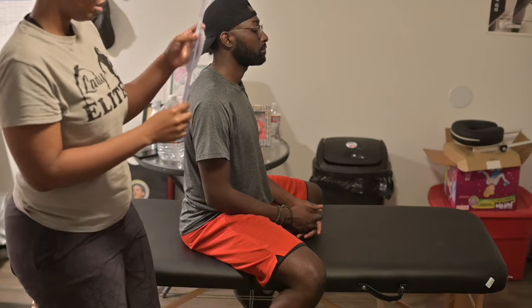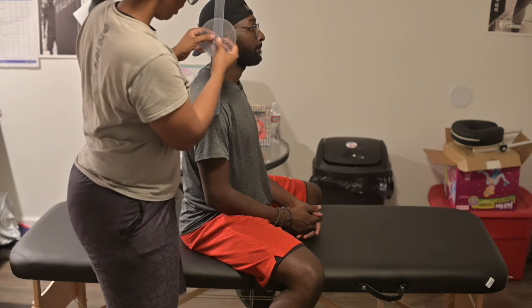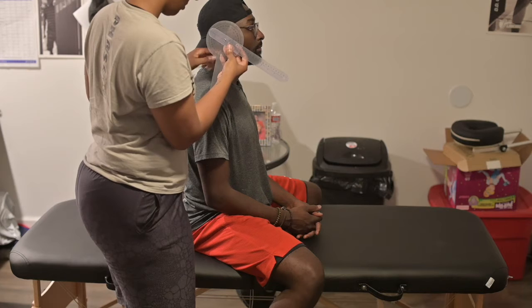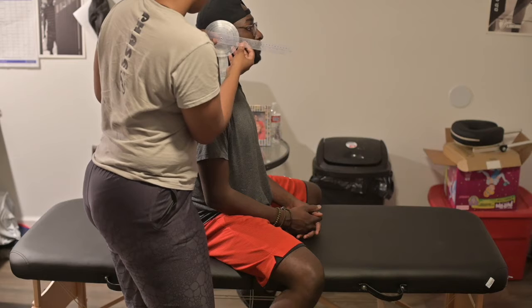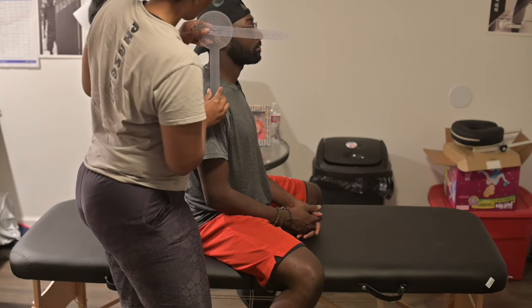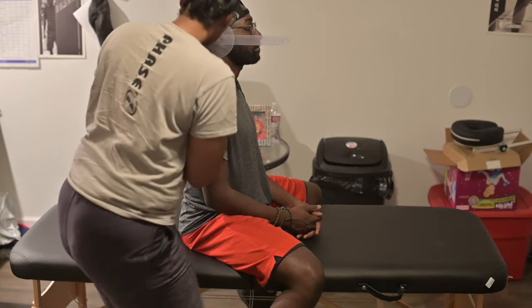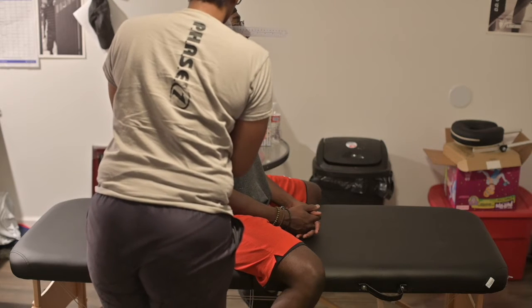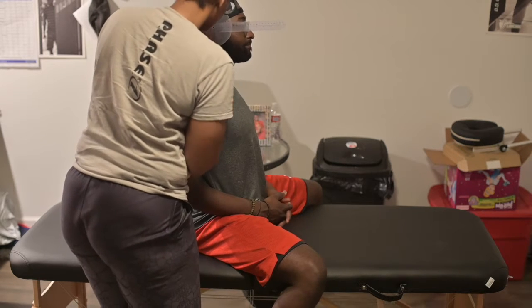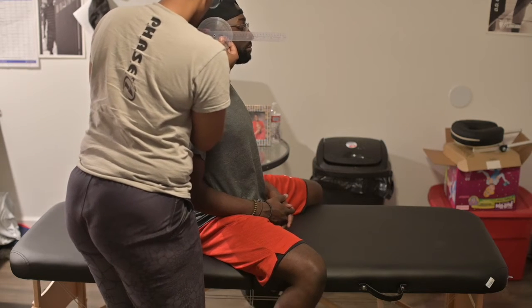We're going to take our stationary arm perpendicular to the floor. Our axis of rotation is at the external acoustic meatus, as I mentioned before, and we're going to align this at the nose. So let's see. Put your shoulders back. Alright, so we're at 90.